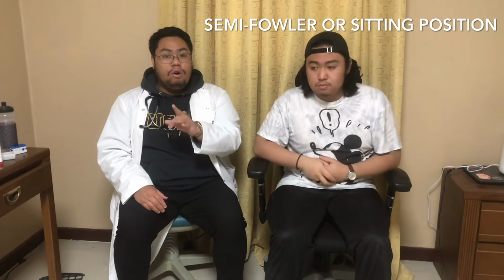After that, you instruct your patient to either be in a semi-Fowler position or in a sitting position. This is because these positions give the diaphragm a better maximal effort and can give us a better result. So make yourself comfortable in the sitting position, sir. Then, after making sure that the patient is in a sitting position, now we assess their vital signs.